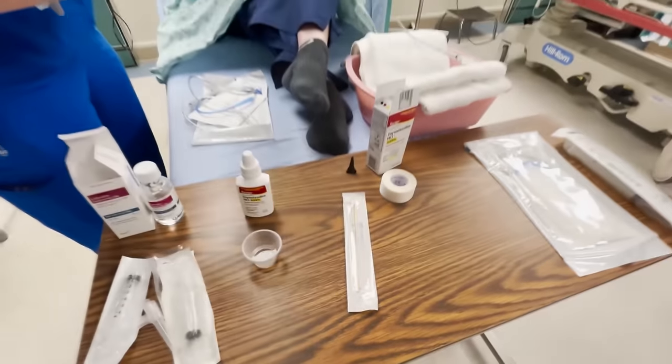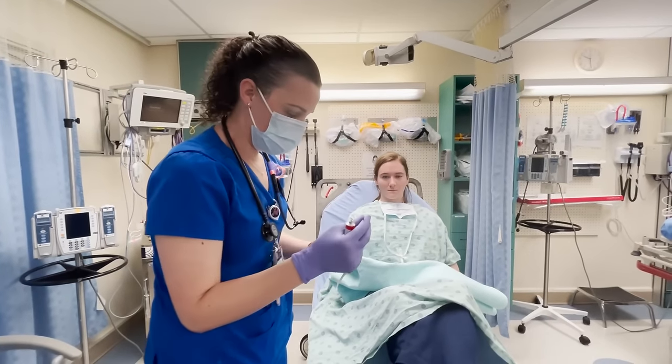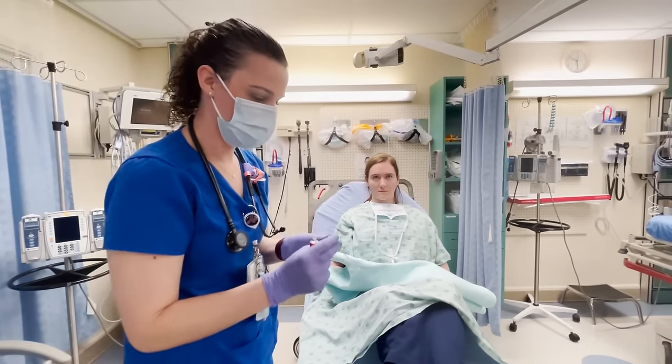So we have 2% lidocaine jelly, and I'm going to use this in several different ways. Do you have a tendency to have nosebleeds at all? Because we do have the option of using the Afrin nose spray.